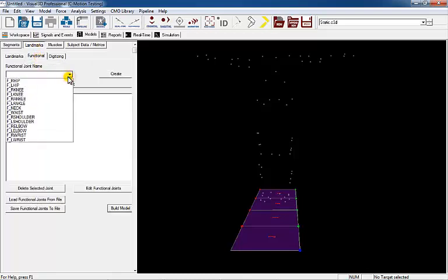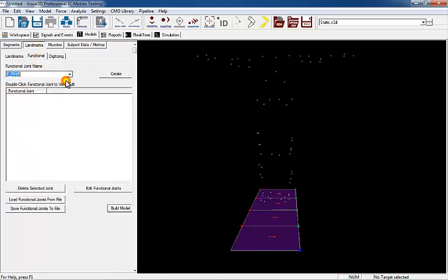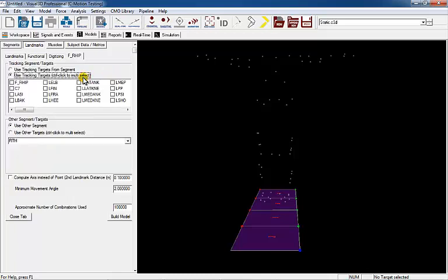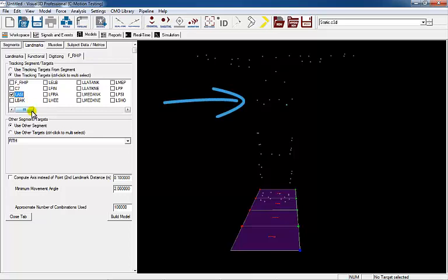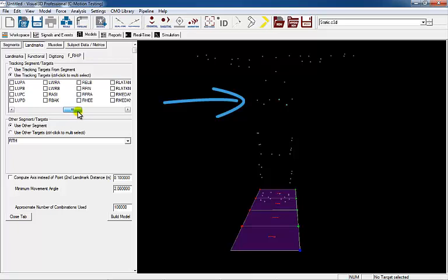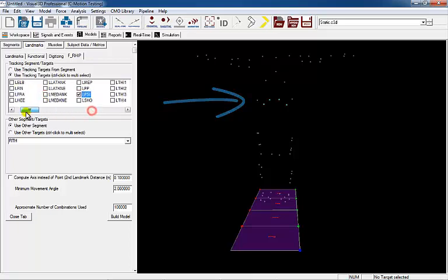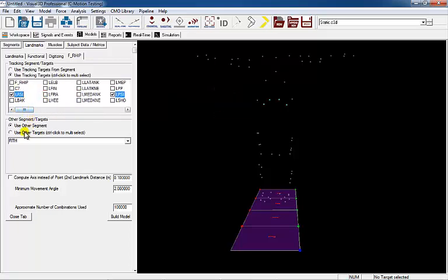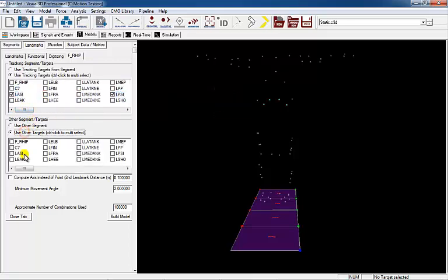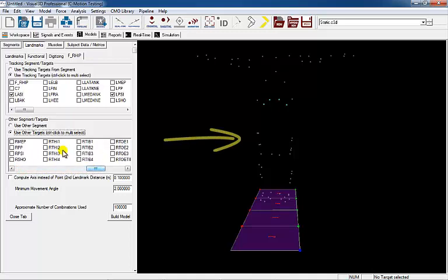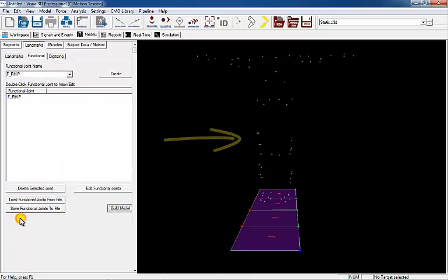Select FR hip and create. The tracking targets for the parent and child segments of the right hip joint must be defined. Once the segments are defined, select Close tab.